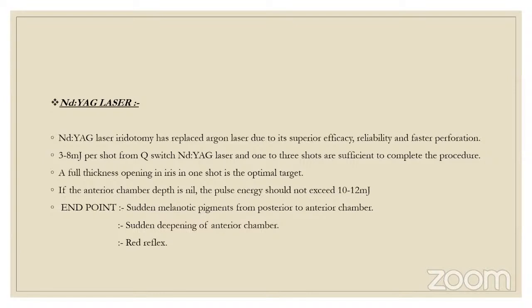If the anterior chamber depth is nil, the pulse should not exceed 10 to 12 millijoule. The endpoint is sudden flow of melanotic pigments from the posterior to anterior chamber, sudden deepening of the anterior chamber, and red reflex in slit lamp retro-illumination.